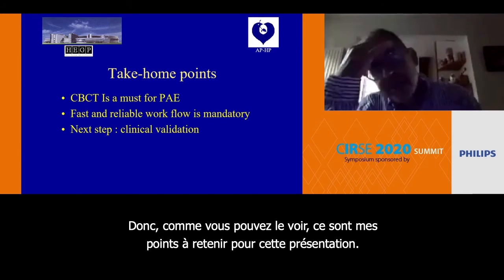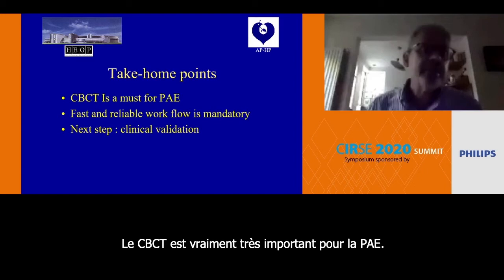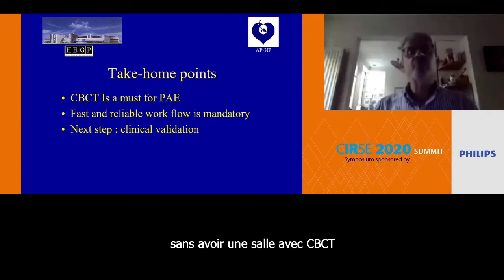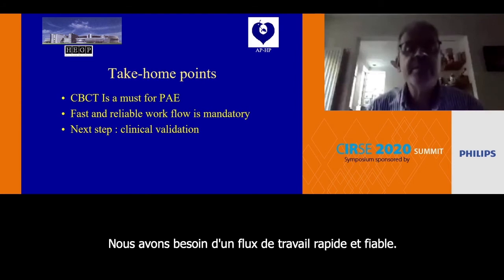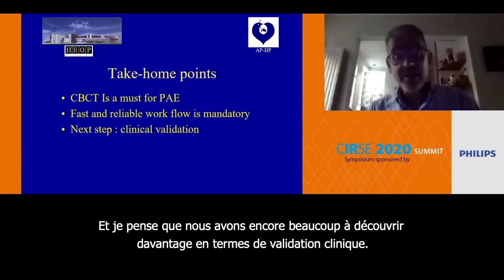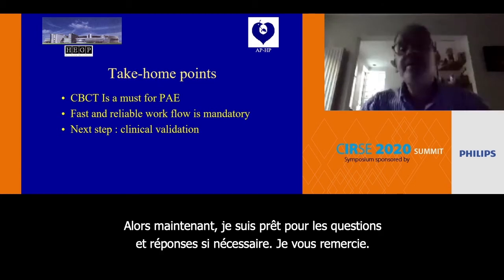So as you can see, and these are my take-home points for this presentation, cone beam is really very important for PAE. I don't know how we can do prostatic artery embolization without having a room with a cone beam CT. We need a fast and reliable workflow. Otherwise, you cannot really manage, you cannot use it. And I think we have a lot to discover more in terms of clinical validation. So now I'm ready for question and answer if needed.